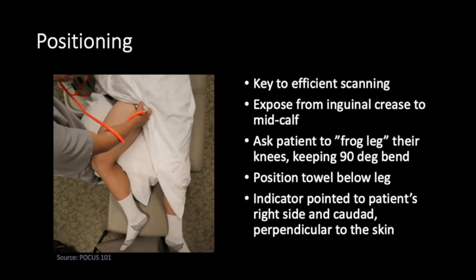To position a patient for this exam, expose the patient from the inguinal crease to the mid-calf and ask them to bend their knee out to the side — kind of like a frog-like position. It's often helpful to roll a small towel or place a pillow under the patient's knee or thigh to help with positioning and reduce discomfort. The probe indicator marker should be oriented towards the patient's right side, parallel to the inguinal crease, intending to catch the vessels transversally.